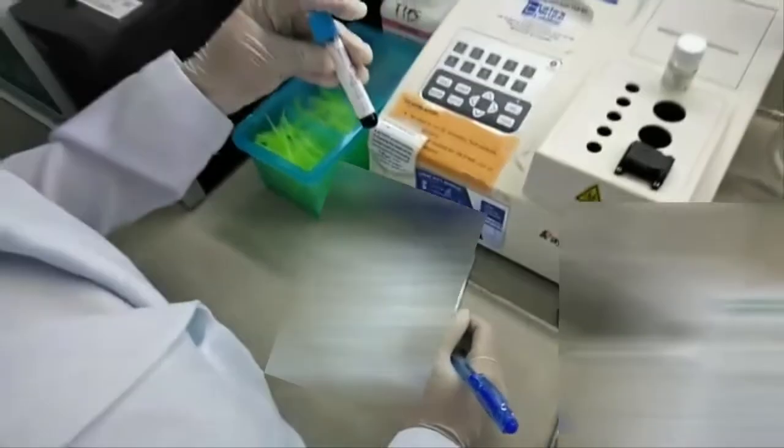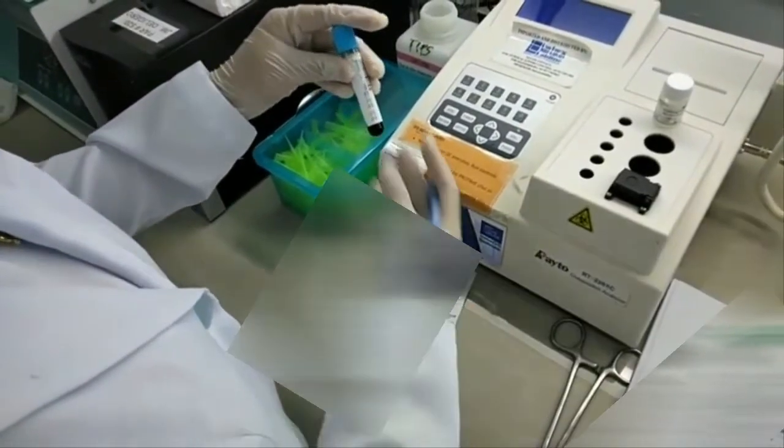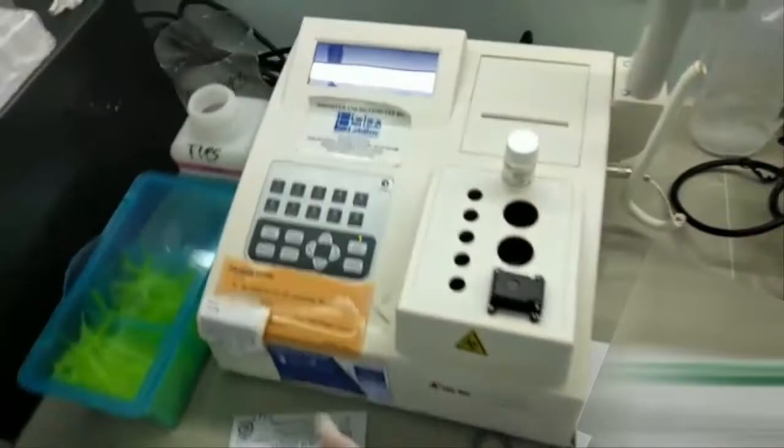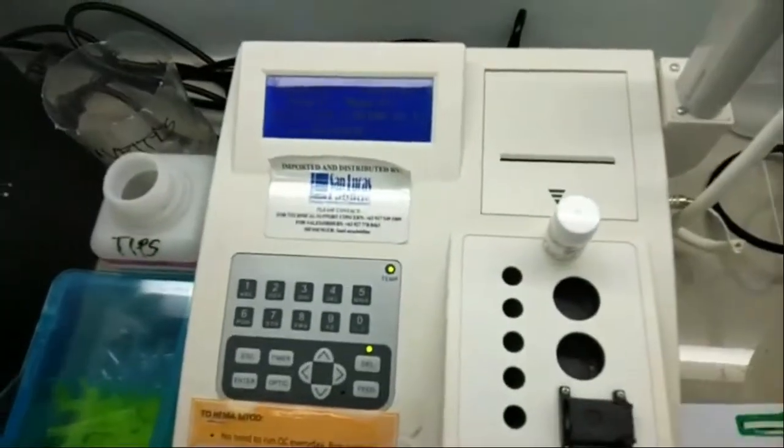Percent activity is computed by dividing the control value, which is 13.5, over the PT result, multiplied by 100.